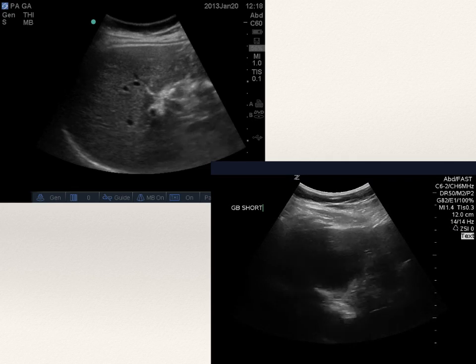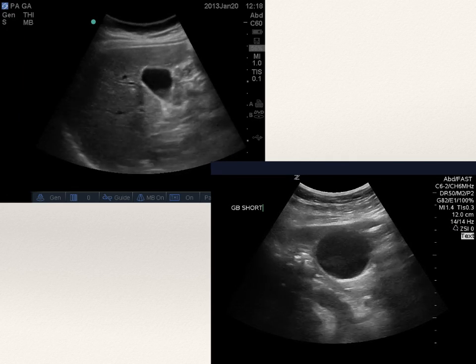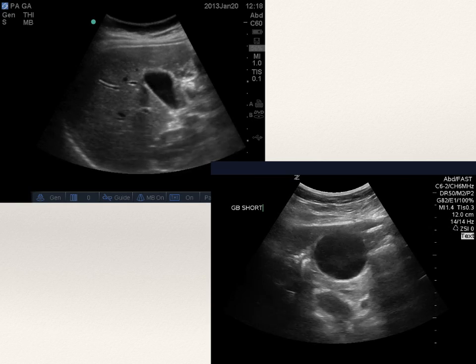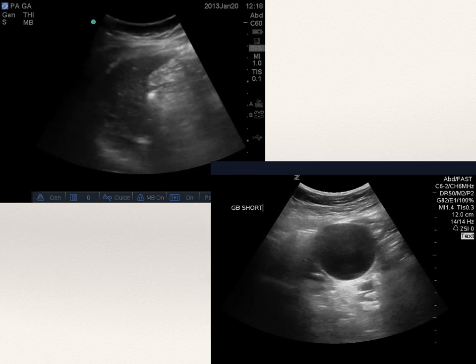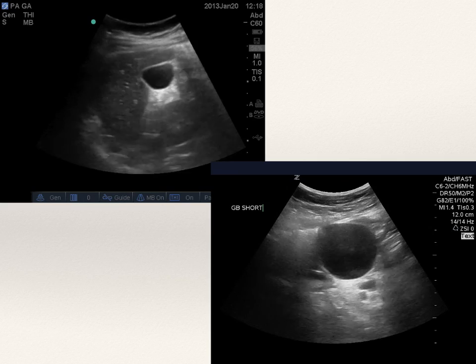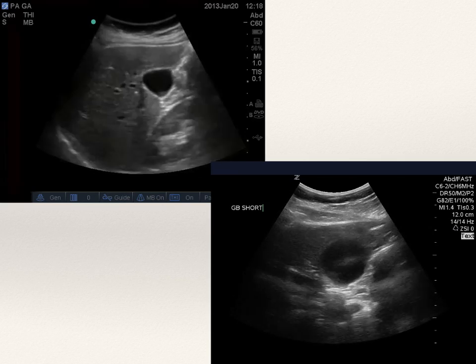In both of these clips, the gallbladder is being assessed through its entire length in the short axis. You can slide or sweep, but be aware that you could potentially falsely elongate the gallbladder if you're sweeping. Again, the one in the left upper part of the screen is probably the better one because we can see it sweeping all the way down to the portal triad. To the screen left of it is the liver, and deep to it we can actually see the right kidney as well.